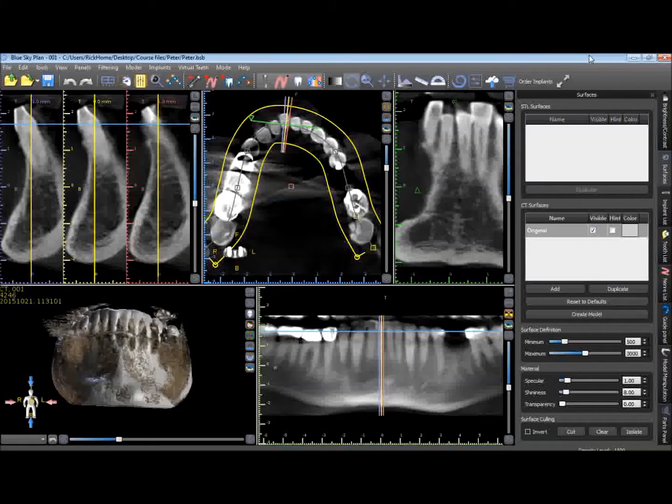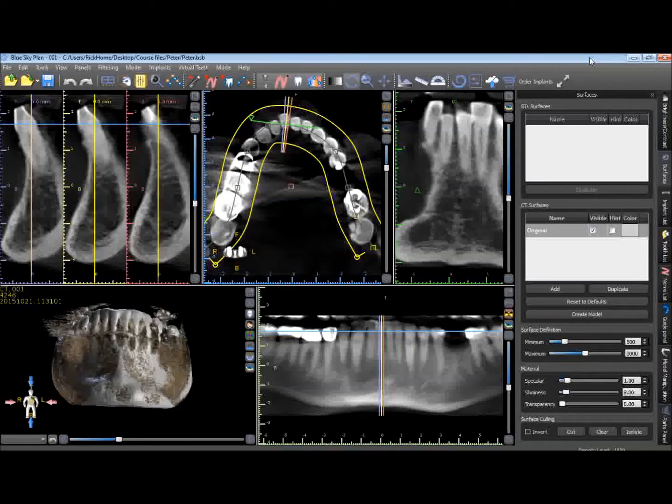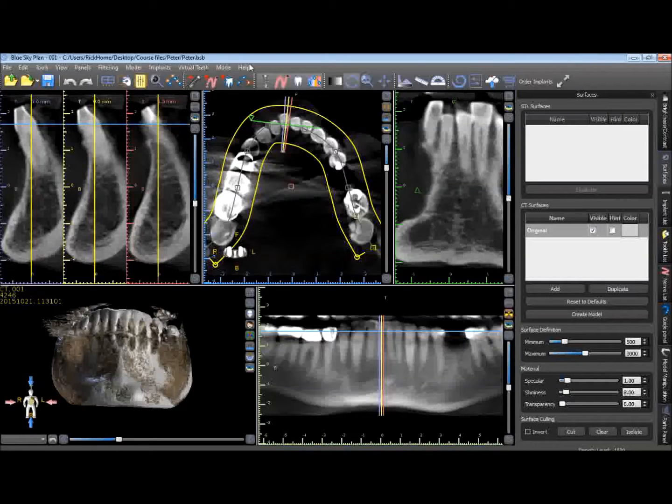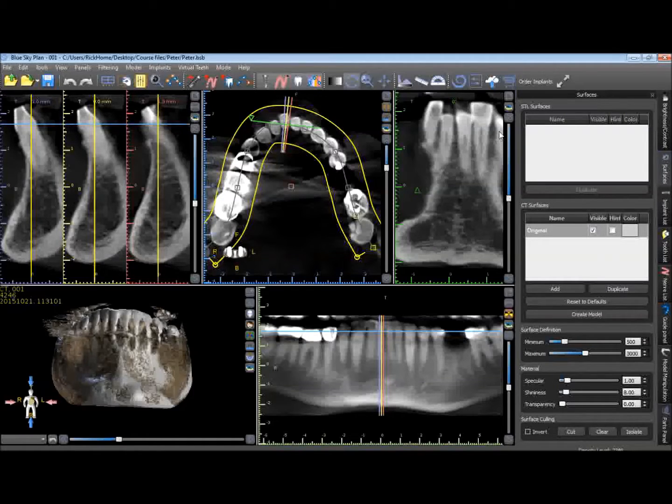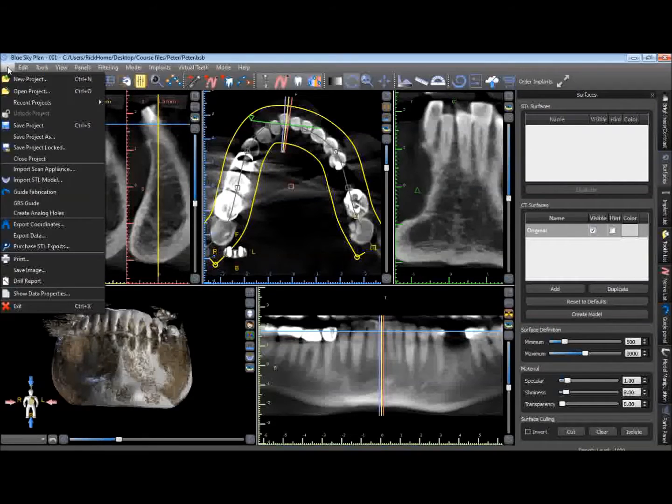We'll be then reversing that impression and bringing it into the guide fabrication software, Blue Sky Plan, and then we can use that clean dataset to create a surgical guide. So the first step in doing this is to open up the patient's jaw scan in Blue Sky Plan, which we've already done here.